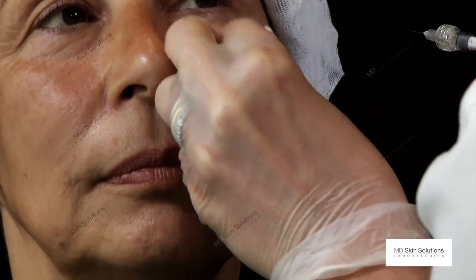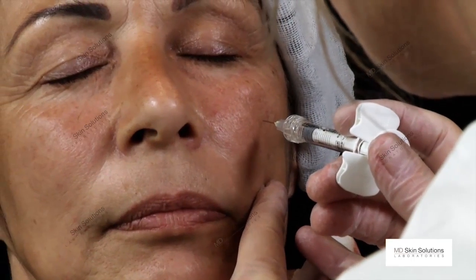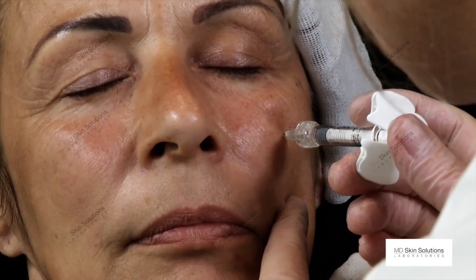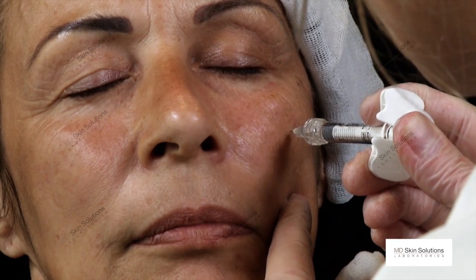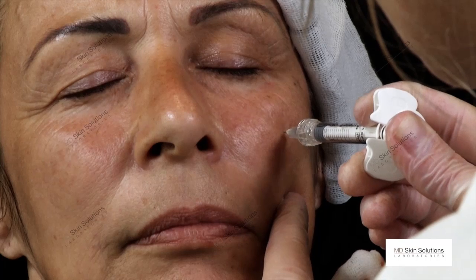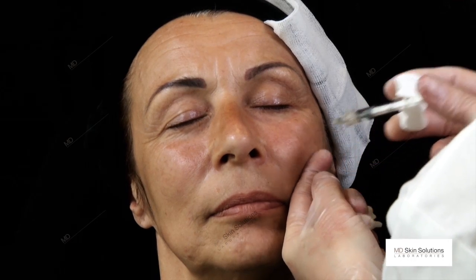Second entry point is the cheek apex point. And I do inject in a bolus-wise way, touch the bone, withdraw the cannula. The second point is in a banana-wise way. Aspirate again, and inject the material here. It's a 0.1 per bolus.